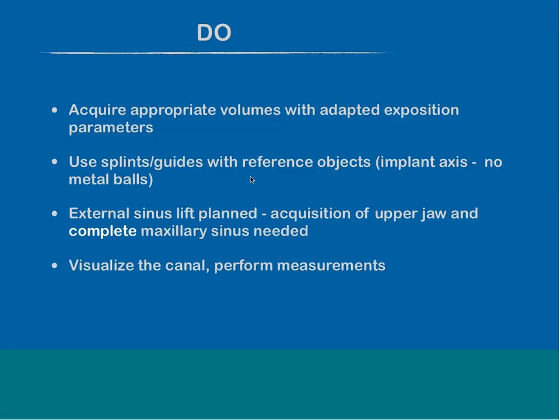If you plan implants in the lower jaw, visualize the canal and perform some measurements. It's really clear. You have to do it as well in the upper jaw and make some proper reports. Make scout views like you've seen before, and in addition some separate transections, and save these images, so you don't need to open the whole data set when you talk again with your patients.